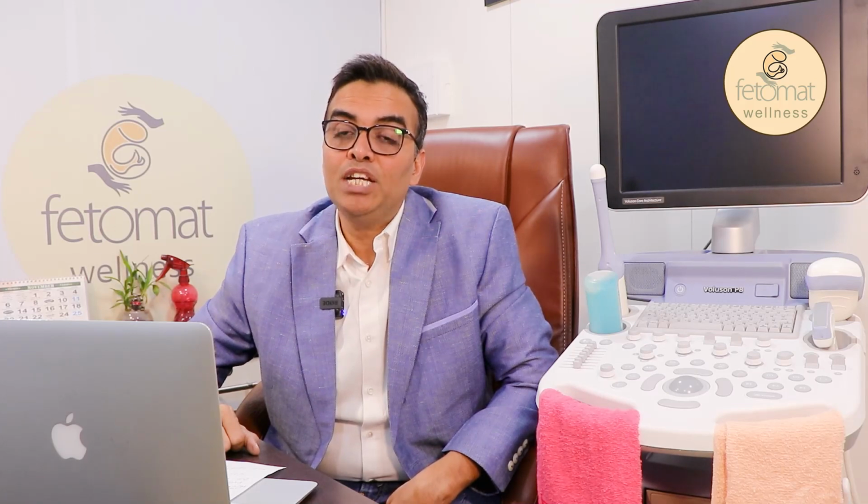And at the same time, we are also looking into the myometrium of the uterus in much more detail to look for any focal or diffuse pathology. When I say focal pathology, the most common focal pathology is in the form of fibroid. And not only documenting or measuring the fibroid is important. The most important thing when we look at the fibroid is to do the fibroid mapping.